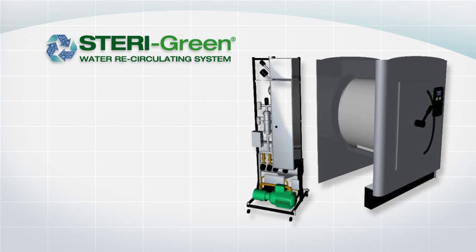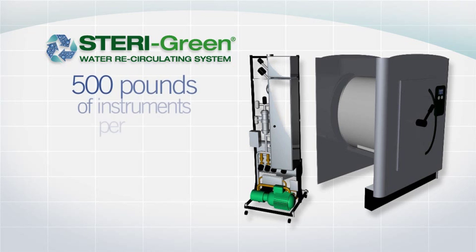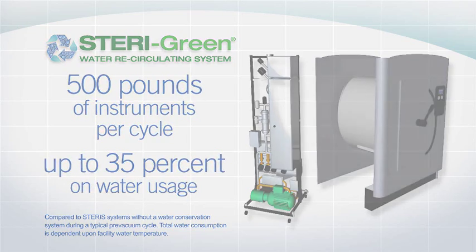The Steragreen system used with the Evolution Steam Sterilizer can sterilize as much as 500 pounds of instruments per cycle and saves up to 35% on water usage.